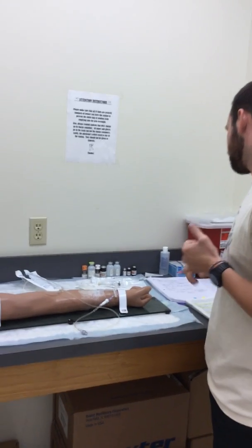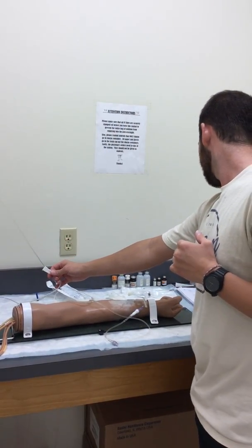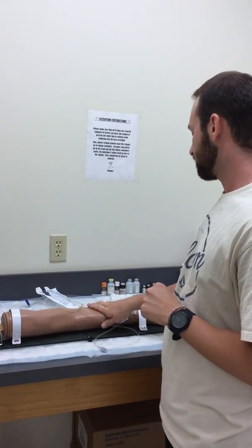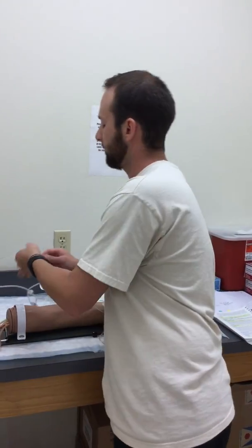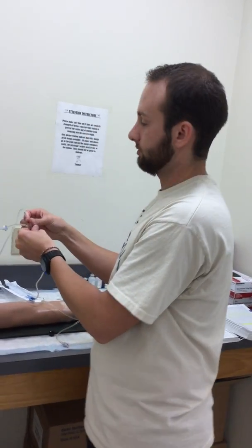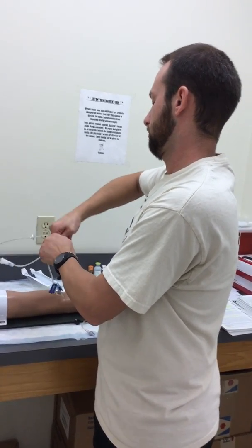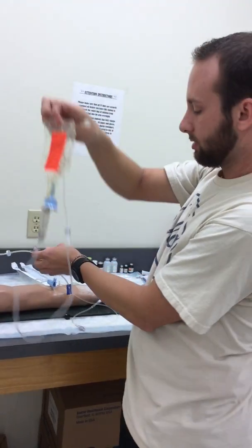you're going to give the piggyback over 20 minutes with milliliters an hour. And so make sure that this would go over 20 minutes. So we do that 150 milliliters an hour and then 25 drops a minute. Okay, now we're going to make sure that the arm is still good. And after that, when we're done, we're going to unplug, we're going to clamp this one off. And then we're going to unplug this. And we're going to want to waste this into the garbage.